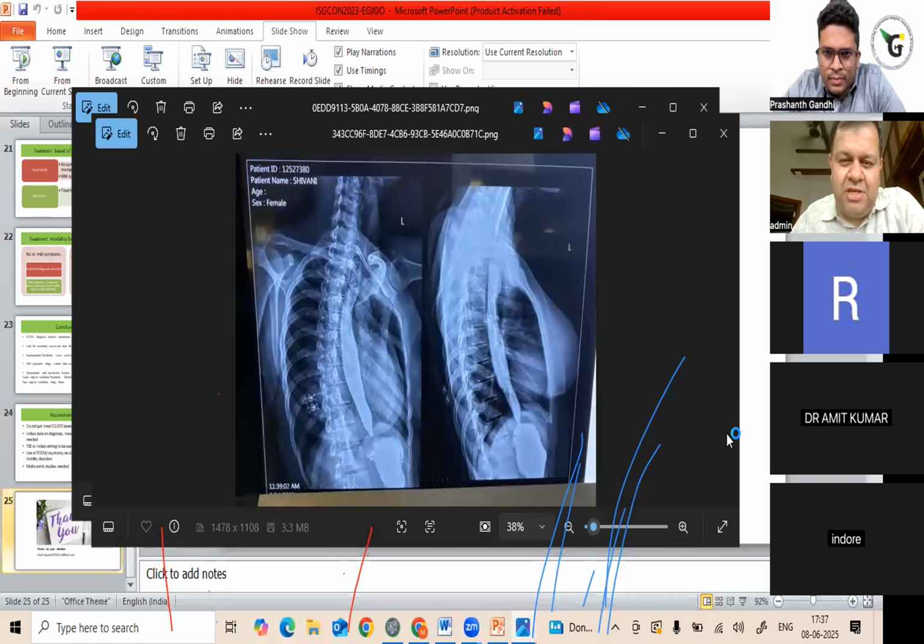So if the patient is having significant clinical symptoms, there is impaired emptying, and we have definite evidence of EGJ non-relaxation on manometry, whether it is EGJ outflow obstruction or achalasia cardia, management would be along the same lines. Maybe if we just follow up this patient for 3 months or 6 months, we might find classical features of achalasia cardia. So probably this is a gray area or an overlapping feature.